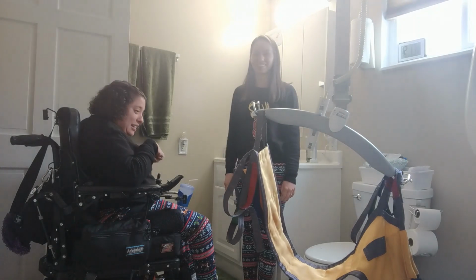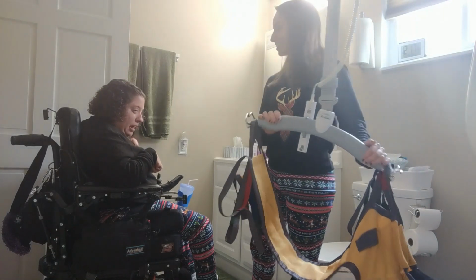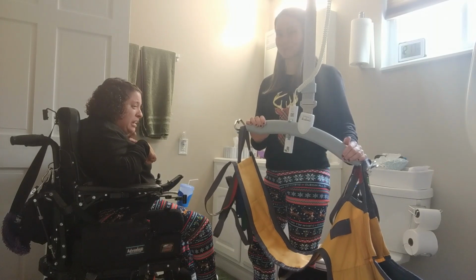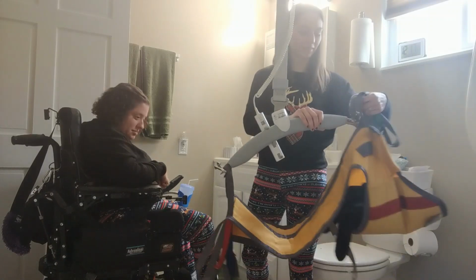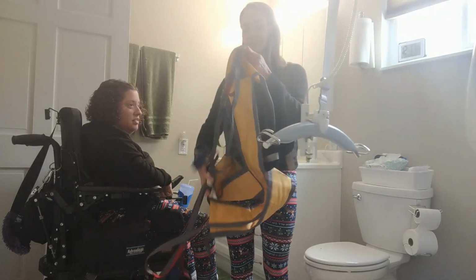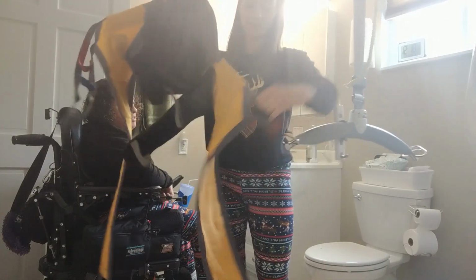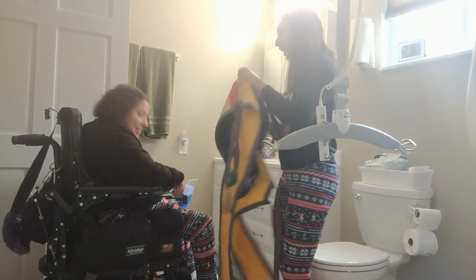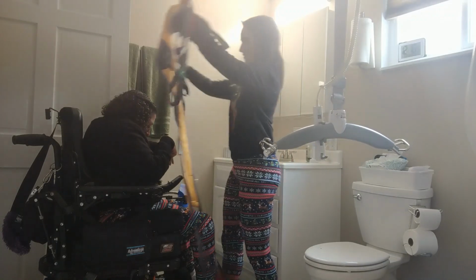This is Ari the Amazing, Dream Team member extraordinaire. She's going to demonstrate putting on a sling, and she's going to talk through this, because if I do it, I'll get too stiff for Ari to put the sling on with my tight muscle tone. So we got this sling here, and you want to make sure you're putting the right things in the right places. So this part goes on her back, and then these straps go under her arms, and then these ones go under her legs. Right. And then I slide forward like this.